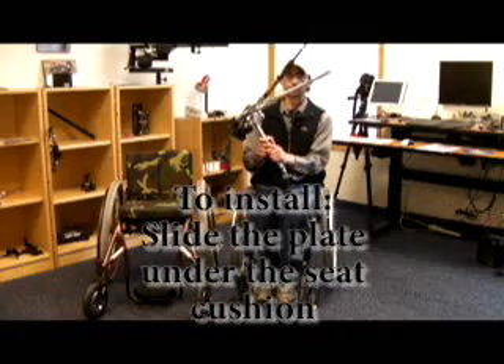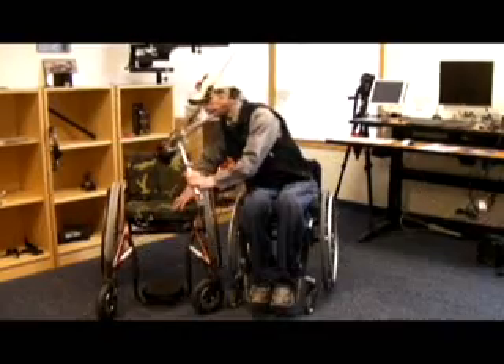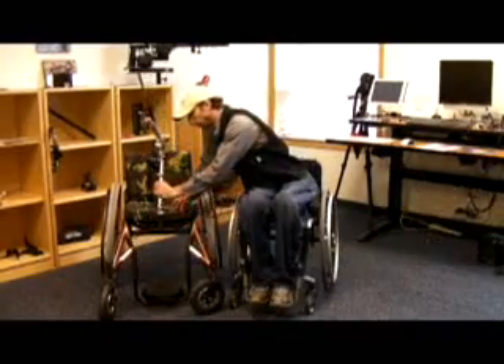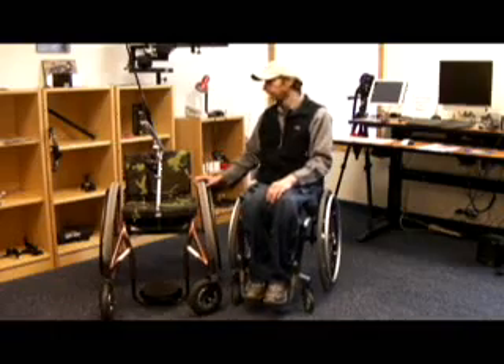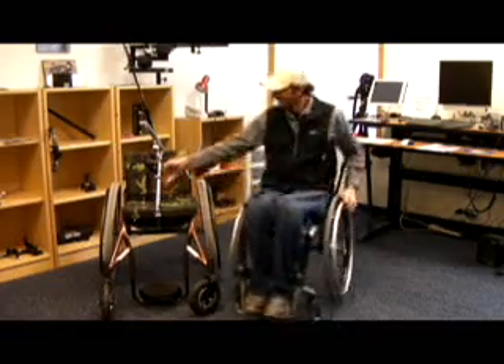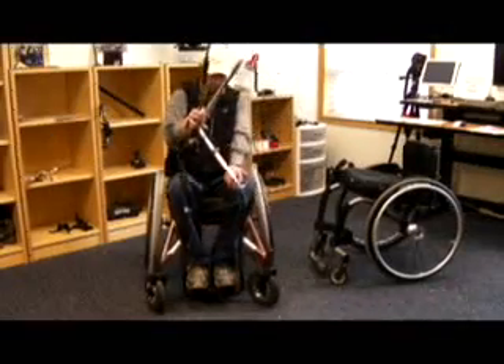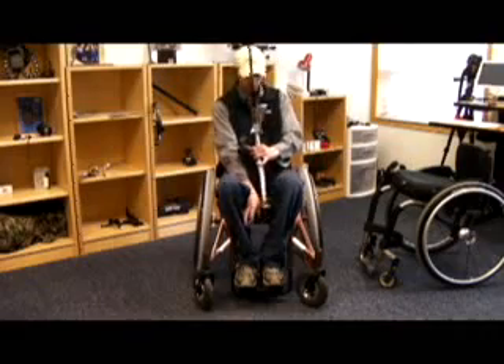To install, simply slide the plate underneath the cushion of the wheelchair. Now, I will hop in. Installation is simple and easy — it just slides right under the wheelchair cushion.